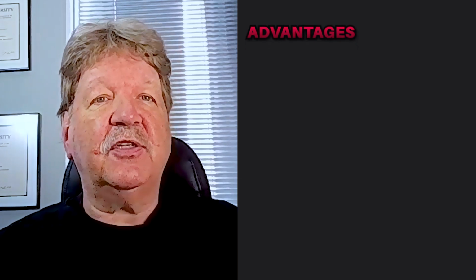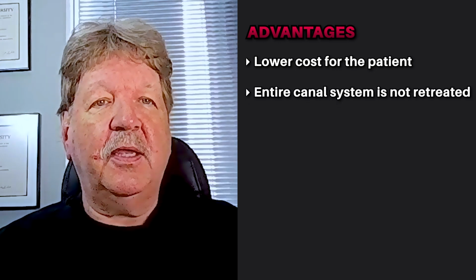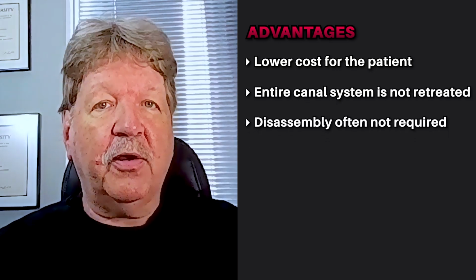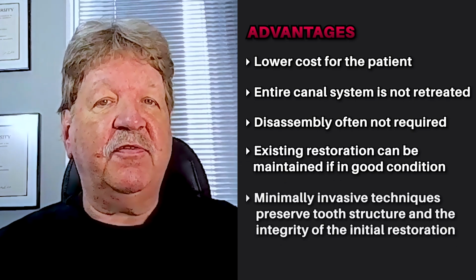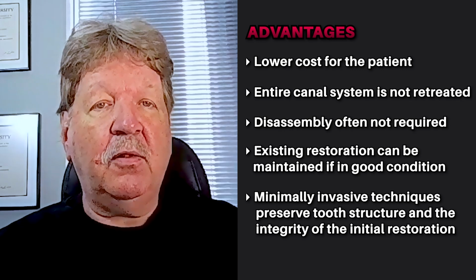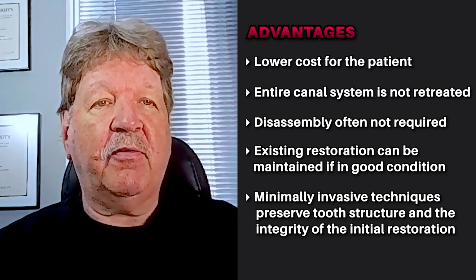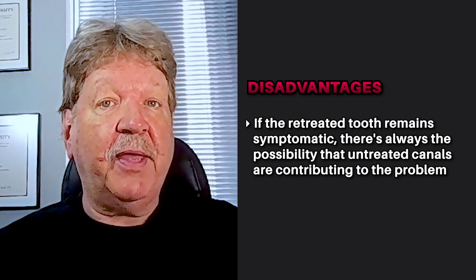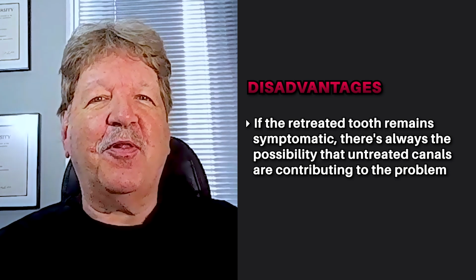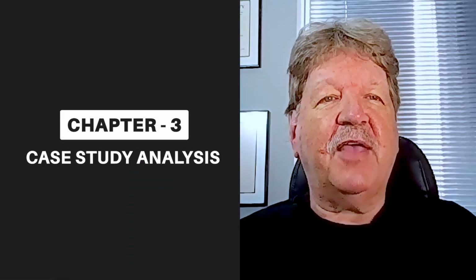This has both advantages and disadvantages. Obviously, the advantage to the patient is that the cost will be much less because the entire canal system is not being retreated. And in many cases, disassembly is not required. The patient can maintain the existing restoration if it's in good condition, and with minimally invasive techniques, retreatment of the suspect canal or area can be performed with little loss of tooth structure and minimal loss to the integrity of the initial restoration. On the other hand, if the retreated tooth continues to be symptomatic, there's always going to be some question as to whether the other canals that were not treated may be contributing to the problem. Let's look at an example case.